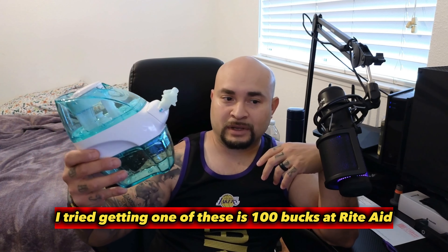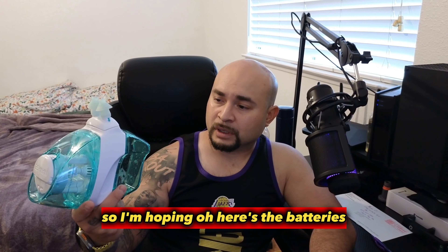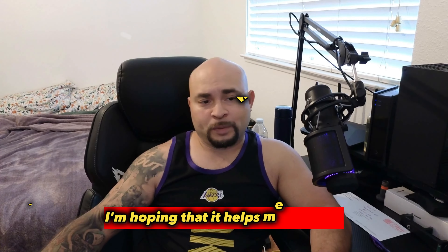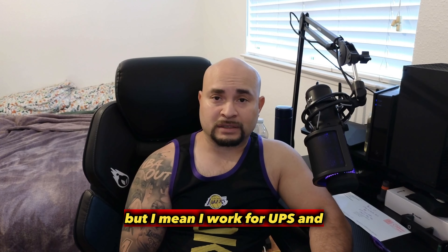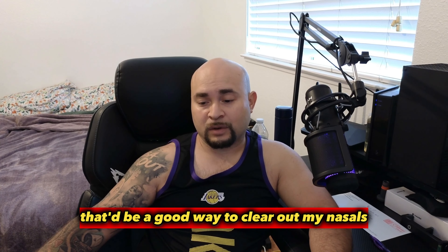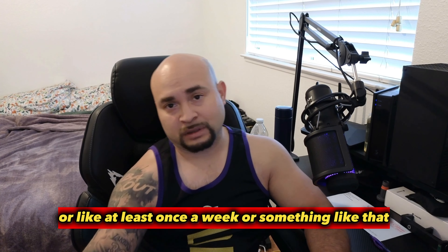These are $100 at Rite Aid. Oh, here's the batteries — they're underneath, so it comes with batteries already. I'm hoping it helps me with my dry nasals. I work for UPS, and it's supposed to clear out all the dirt and everything, so if I use it daily or at least once a week, that'd be a good way to clear out my nasals from all the nasty junk and dirt.